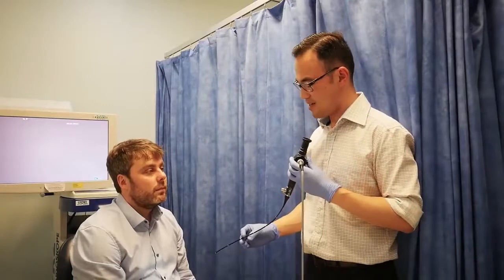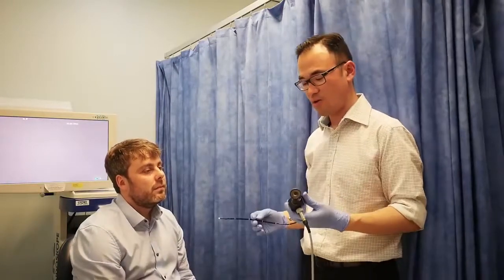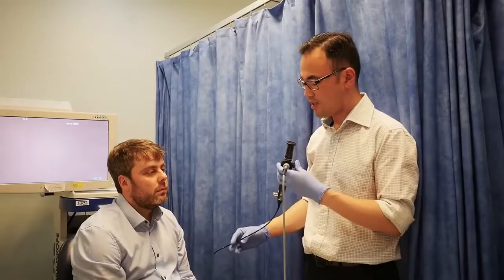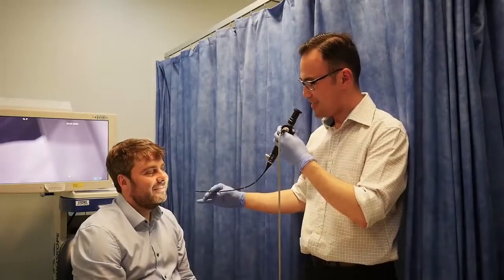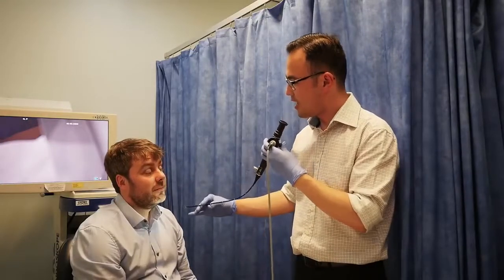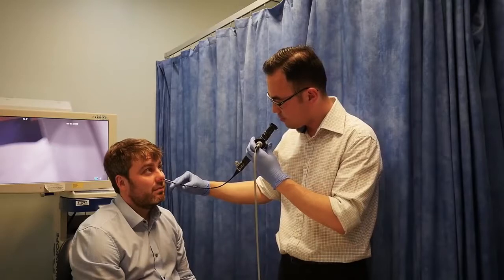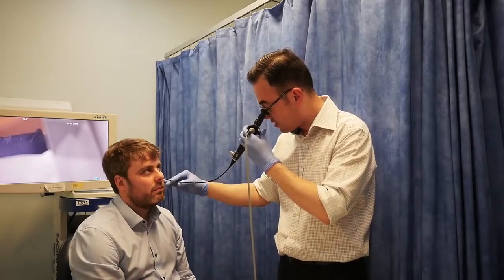Yeah, so in an outpatient setting, you won't have the camera stack, and this is basically all you have. It's relatively straightforward and almost exactly the same. First thing I would do is just again orientate your scope, just looking just at the tip with the patient in view. And as you insert the tip of the scope, I wouldn't be looking at the eyepiece. I would be looking at the patient just to get the tip in, and at that point, move on to the eyepiece and just carry on as usual.